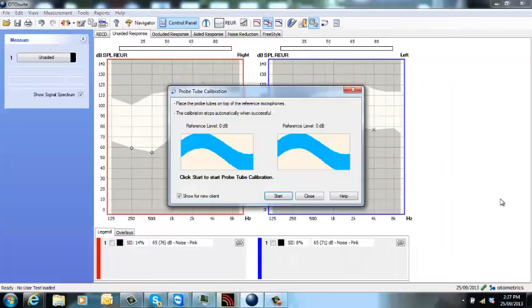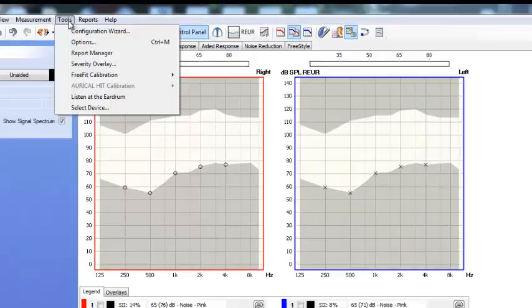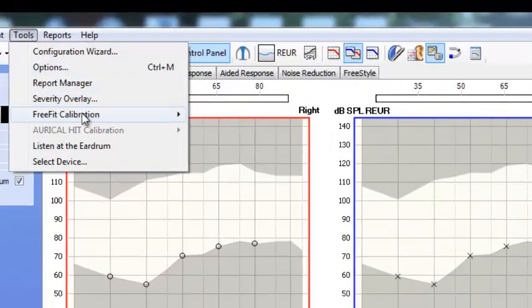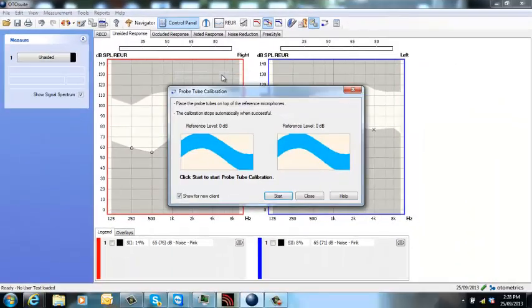Once connected, your probe tube calibration box should pop up. If it doesn't, what you need to do is go to Tools, FreeFit calibration, and probe tube. Now you can press start in the software or you can press the power button on the FreeFit to run the probe tube calibration.